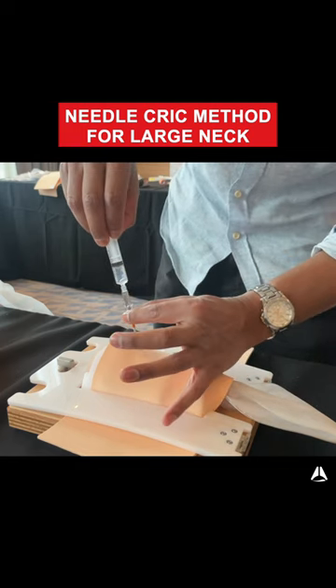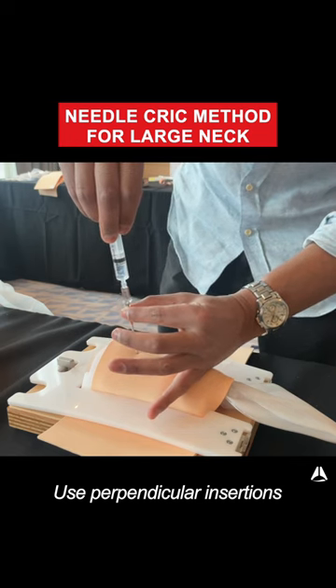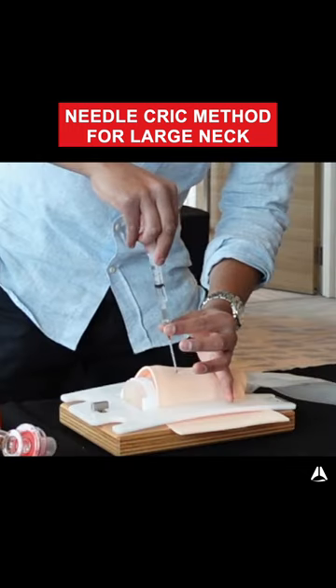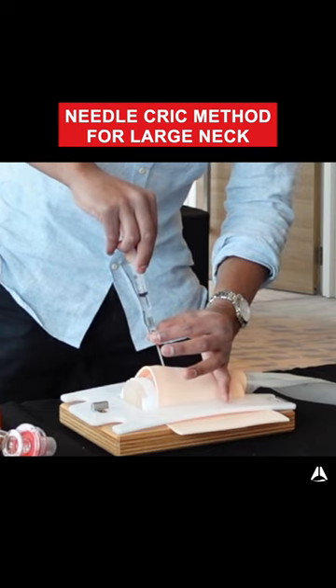I then take the cannula and needle en masse and try maybe one centimetre to the left and right. If that doesn't work, I'll try the other side. You might want to do this just a couple more times trying to find if you can actually find the trachea.